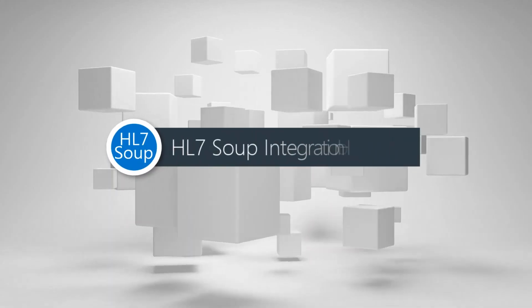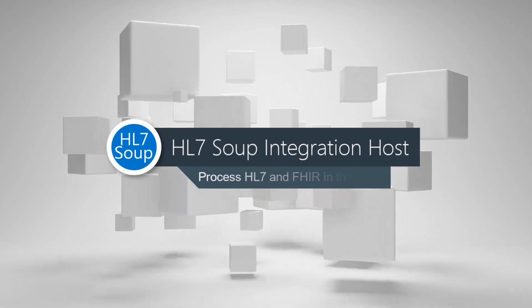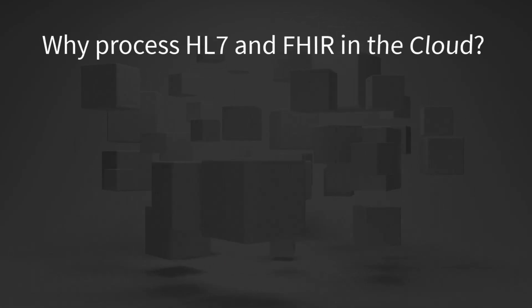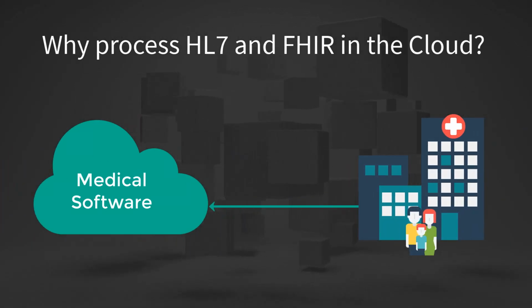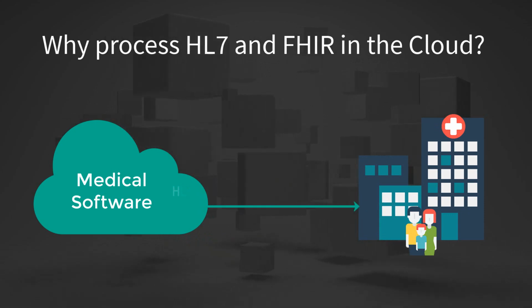Welcome to this tutorial on processing HL7 and FHIR in the cloud. There are a few reasons you might need to do this. If you have a cloud-based medical software, you'll most certainly be asked to accept a patient feed, and you'll need to support both FHIR and HL7 in their different incantations. It goes for outbound messages too. Do you need to send HL7 from your product?